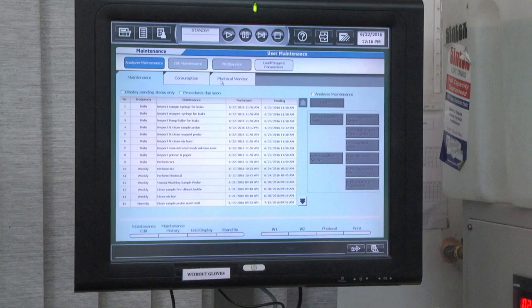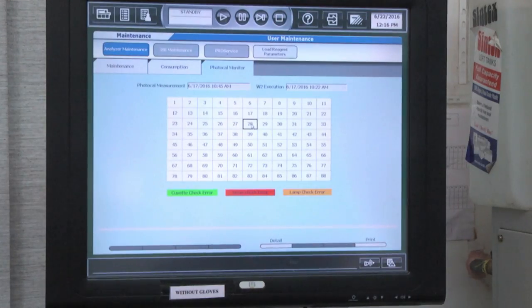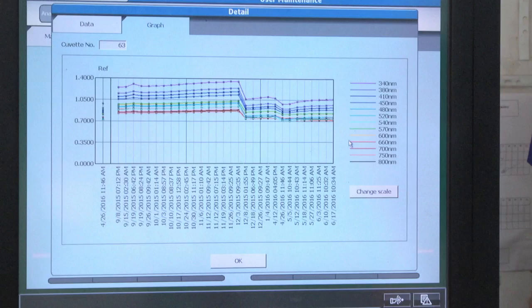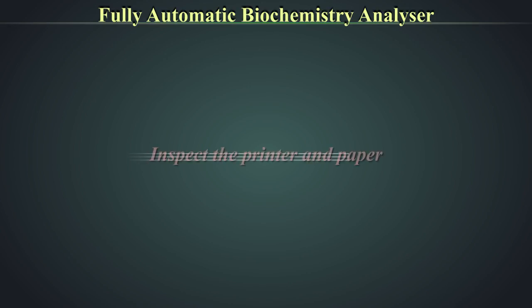Assess the cleanliness of the cuvettes, as dirt, scratches, or fading can interfere with test results. Go to the photocal monitor and select any random cuvette; check its OD or wavelength. Graphical representation of different wavelengths should be within acceptable limits. Any variation will indicate the need for change of the photo lamp or cuvette. Inspect the printer and paper to ensure there is enough for the day's use.